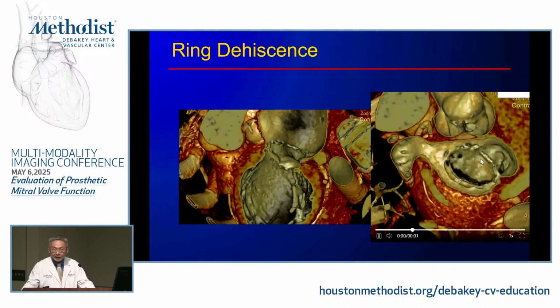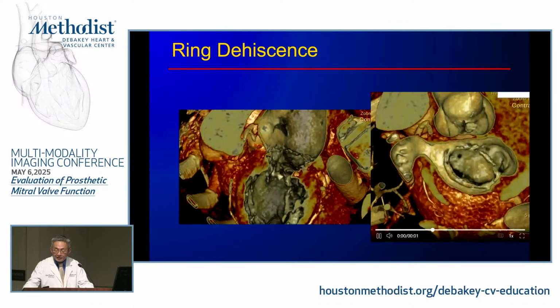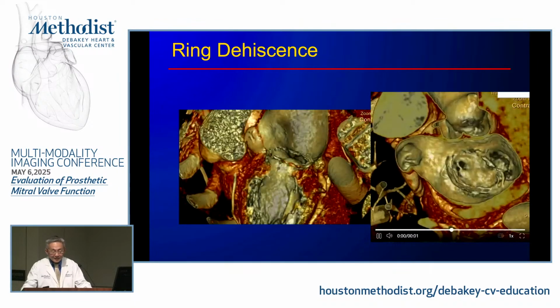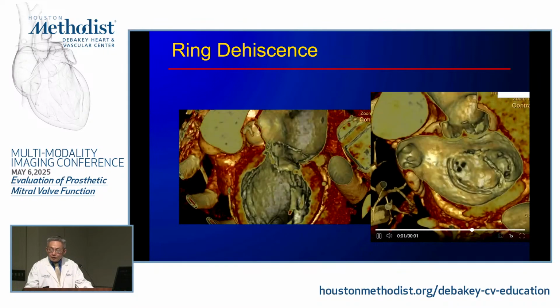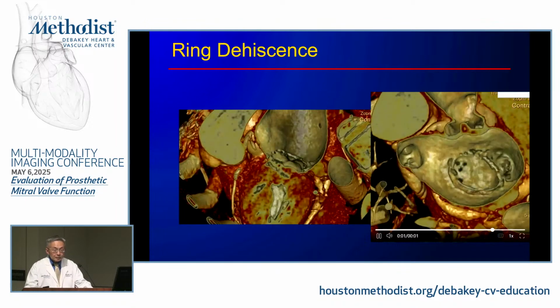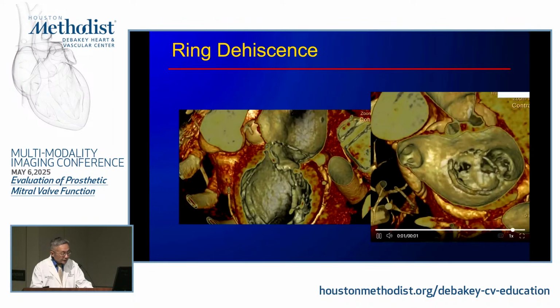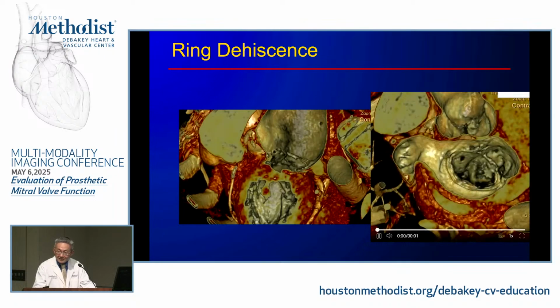Obviously not. Correct, and that's a concept we try to let you guys understand, why Dr. Little, because I feel like every time he mentioned it, nobody really got what he was talking about. But if that gap is resolved by putting another ring and shrinking the annulus surgically back to being smaller, then the native MR will go away. Absolutely. Everybody got it clear? Yes? Good. So we don't want to hear anyone closing this with a closure device.